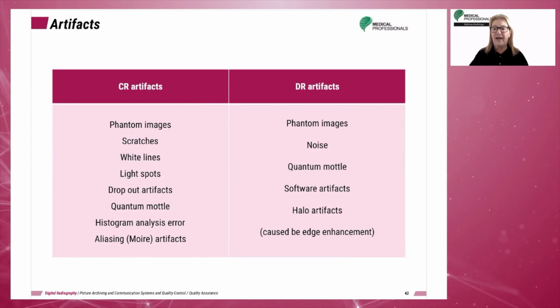Electronic artifacts randomly occur on DR images for a variety of reasons. These can include Bucky motor interference, X-ray tube rotor initiation, extraneous radio frequency signals, and other electronic interferences, according to Carroll.